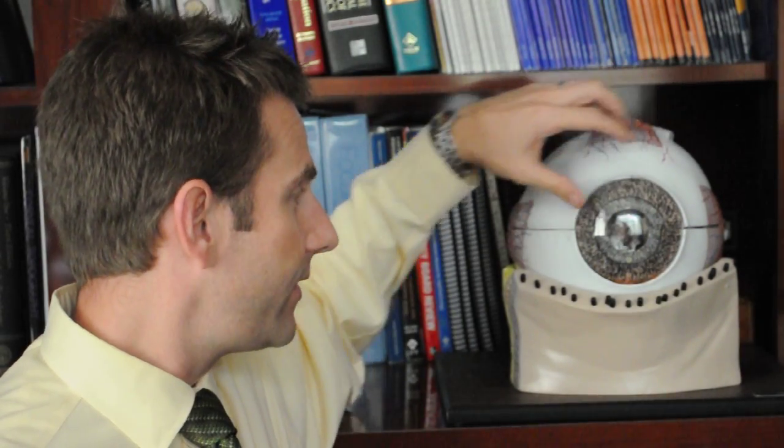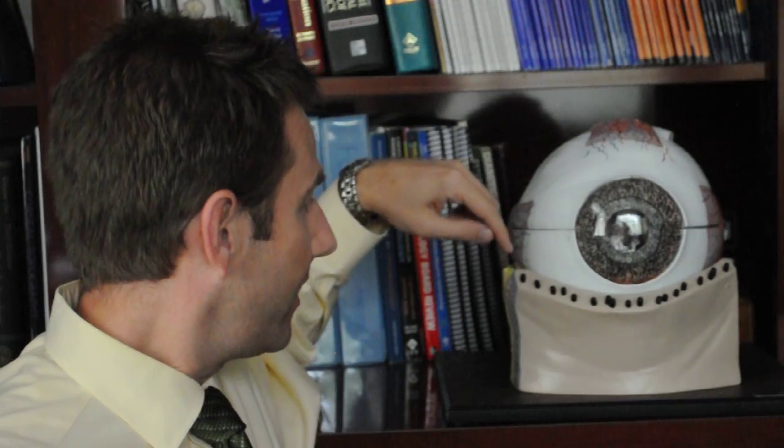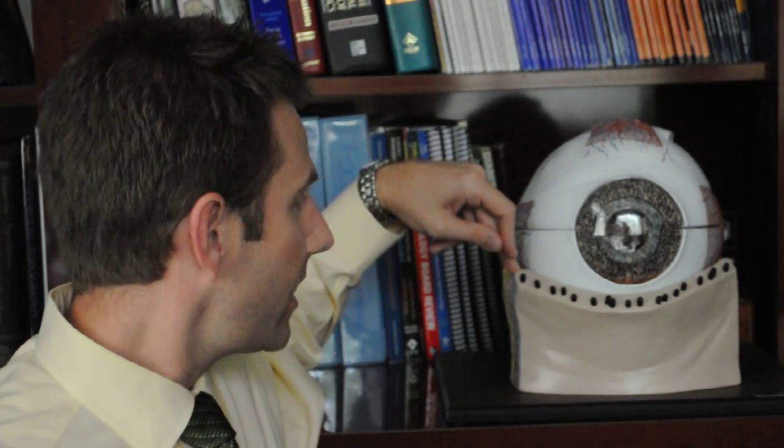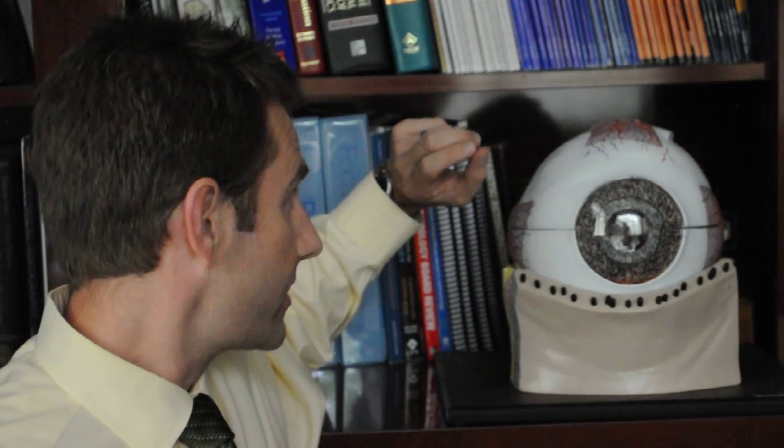These tears naturally are produced and then drained out through the eyelids. If this were someone's left eye, there's one tear drain in the bottom eyelid towards the center and one tear drain in the top eyelid towards the center.